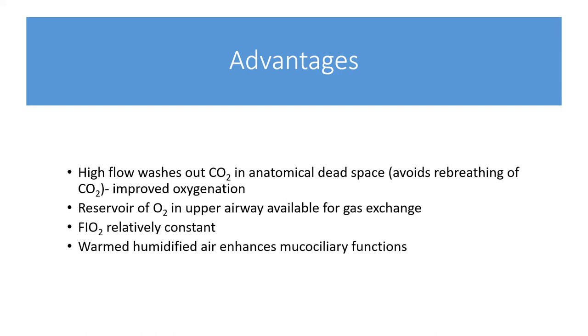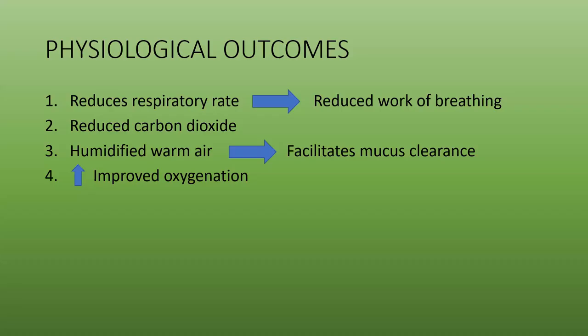All right, so with this in mind, the physiological outcomes are going to be, it reduces the respiratory rate, and by doing so, it reduces the work of breathing. It reduces carbon dioxide because it washes it off from the anatomic dead space. The humidification of the warm air facilitates mucus clearance, and therefore overall, this is going to improve oxygenation.